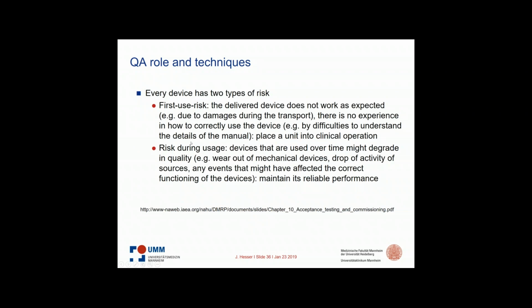So QA role and techniques. This is a very principal part. What are the two issues the QA is addressing? First of all, if you have a new device, the new device, which has never been used, might have a certain risk associated with it before you start using it.